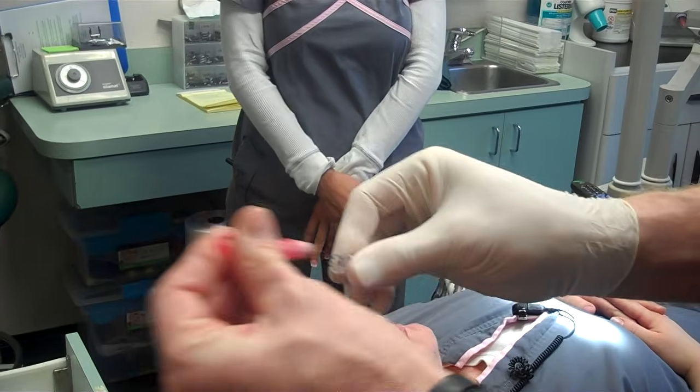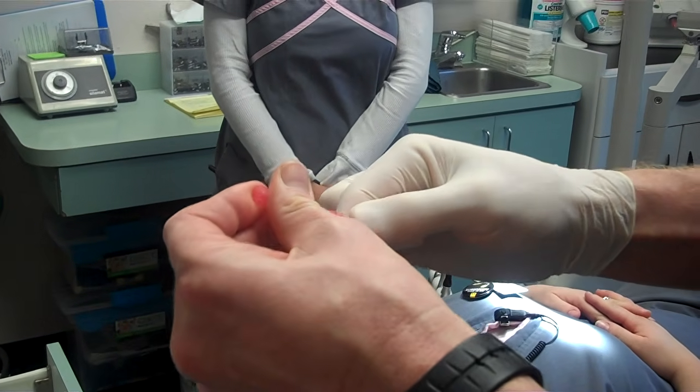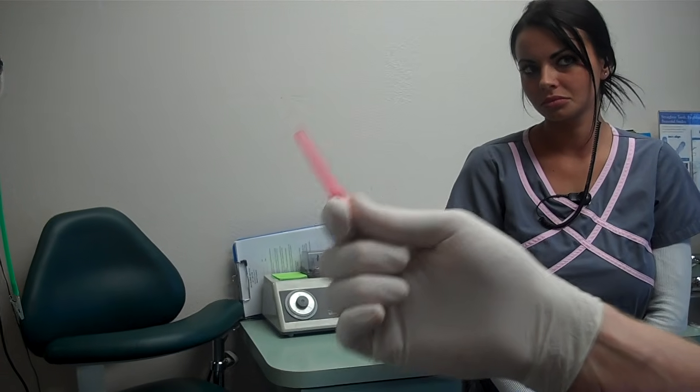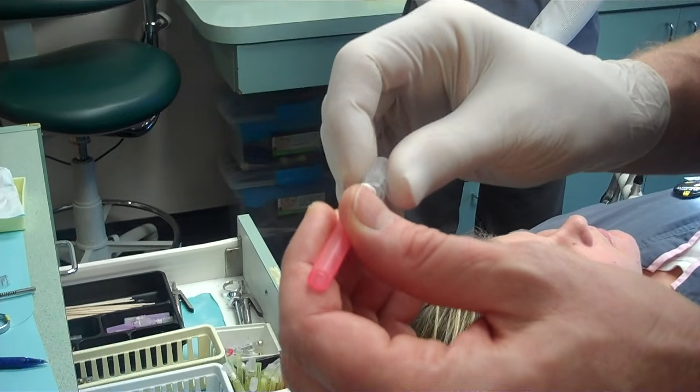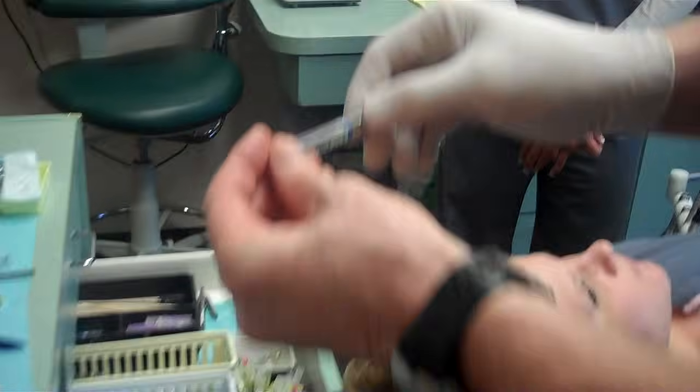There's also this 25 gauge needle. This is a big needle. We rarely use this. We use it almost entirely for oral surgery. Rarely used, but just so you'll know what that is. Also, this blue one, called Marcaine.